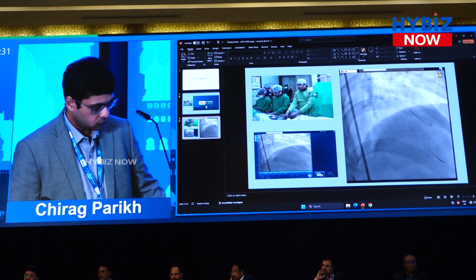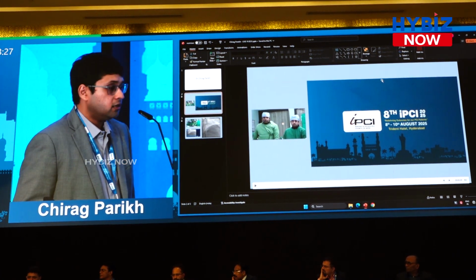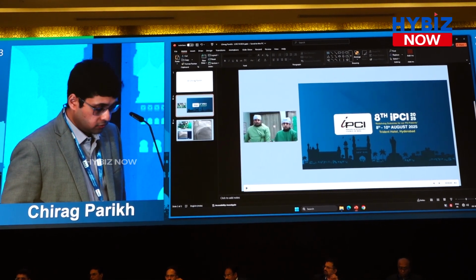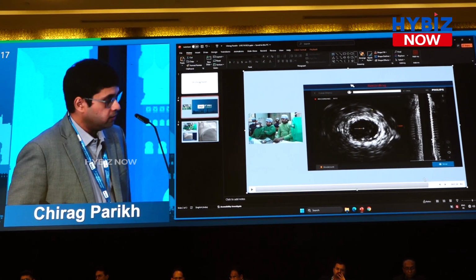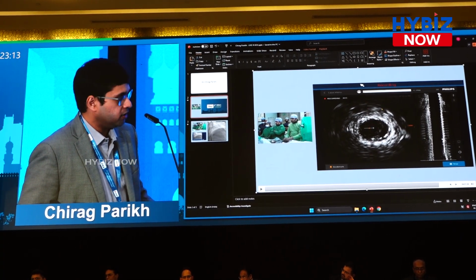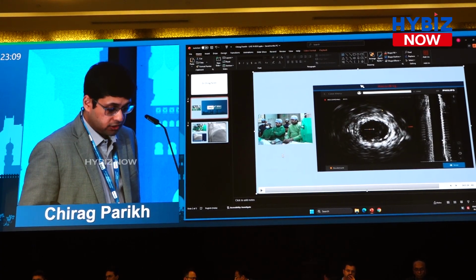Thank you for inviting us. So Chirag, when you did the angio, what did you suspect? There are a lot of differential diagnoses of this lesion, because it could be a recanalized thrombus, it could be a predominantly lipidic plaque. It is unlikely to be calcium because he is a young patient. There doesn't appear to be any angiographic calcification.